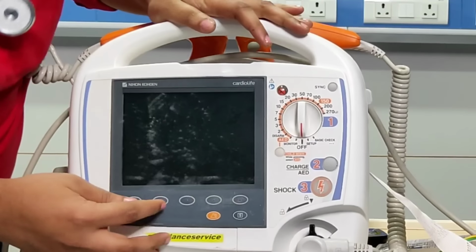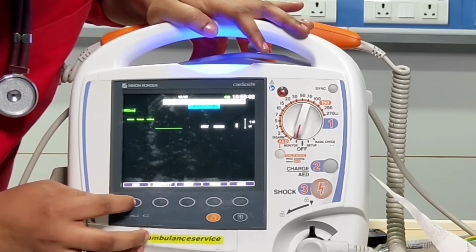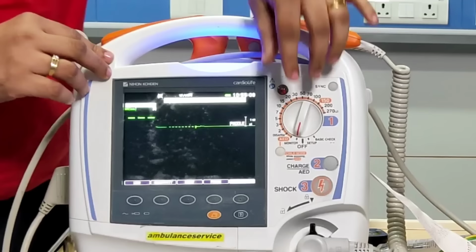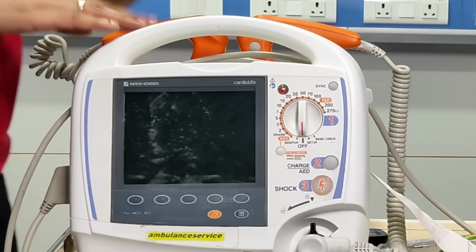The only thing that you need to do here, I have shown you here the lead. So you need to select the lead as the paddle. Lead as paddle. So the paddle will give you the details for that. So that is regarding your defibrillator, parts of defibrillator.